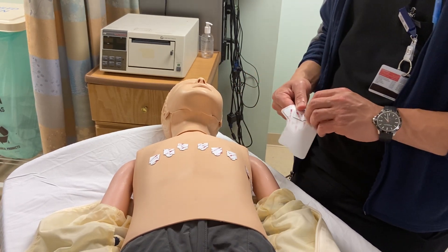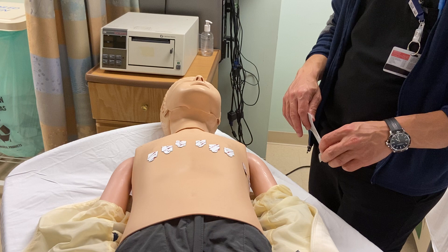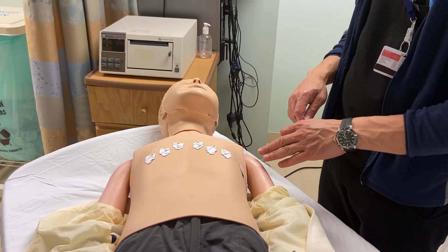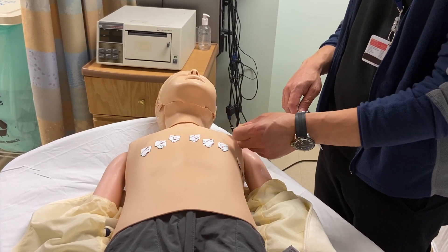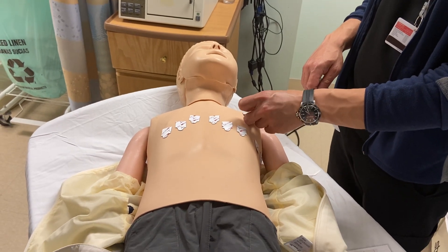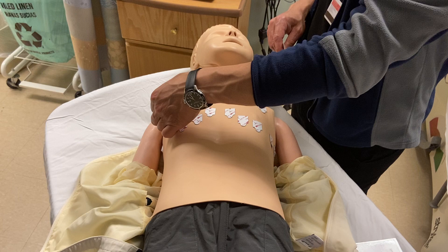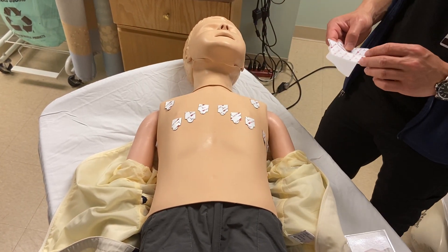Now for our limb leads — we just finished placing all the precordial leads. In children, especially toddlers or babies who aren't able to sit still, if they're moving their arms and legs, it's usually best to put the arm leads just an inch or two below the clavicle — towards the left for the left arm, and similarly on the right side for the right arm.